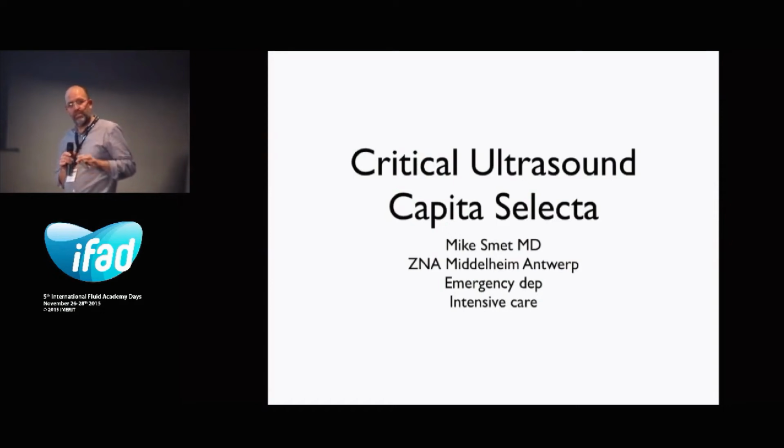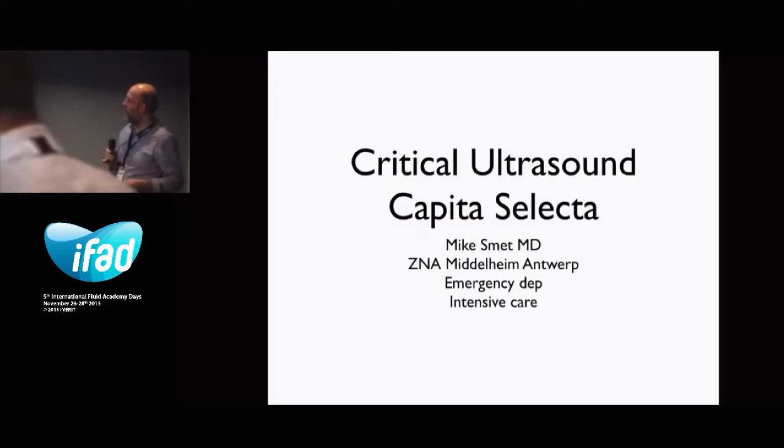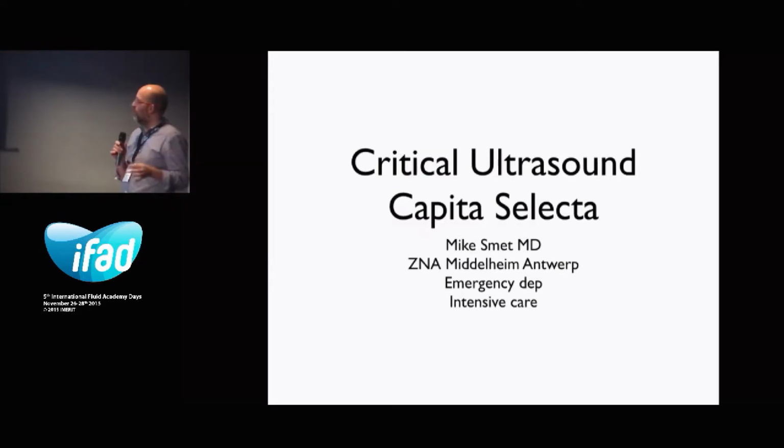A little bit of what is possible with ultrasound in the emergency department and the intensive care unit, because I work in both departments. So we're going to see a little bit about abdominal ultrasound, a little bit about pulmonary ultrasound, and a little bit about cardiac ultrasound, but very basic, what you can do with the basic stuff.